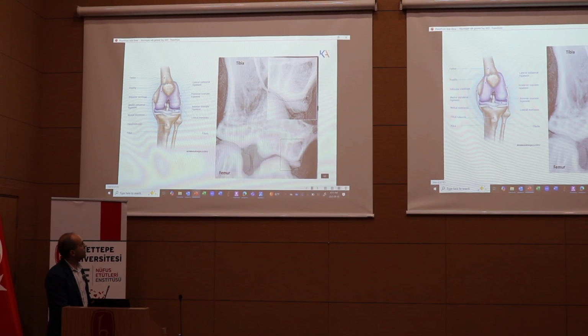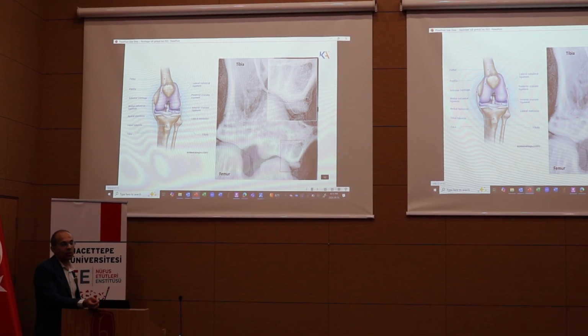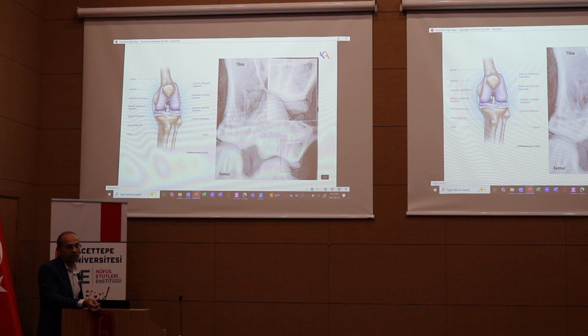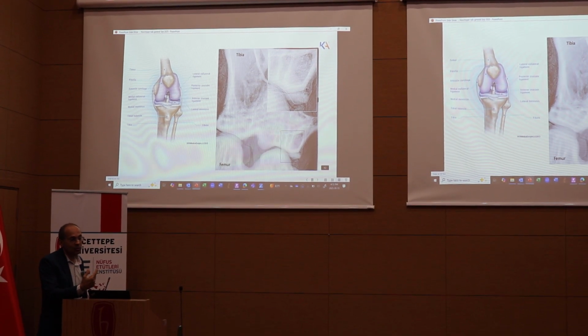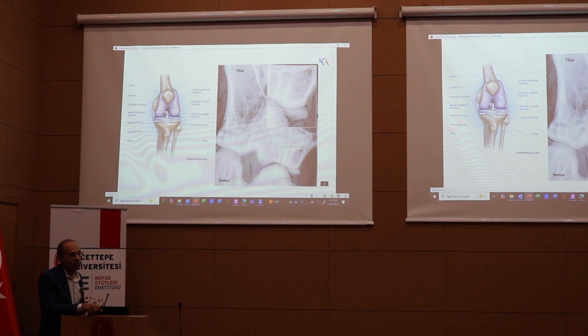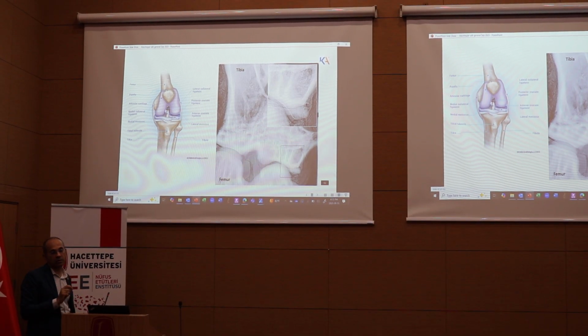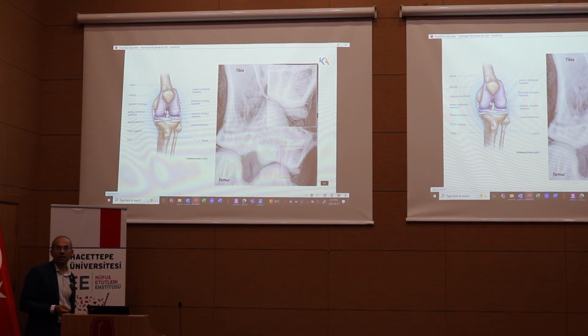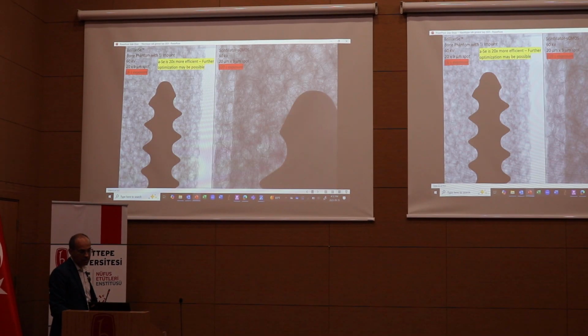What's unusual about this is you cannot see cartilage with an X-ray. Anybody will tell you if you want to see cartilage, you're going to need ultrasound. But this is 50 micron resolution, so an ultrasound will not work. So the only thing that can resolve this is an MRI, where you would run it for like an hour or two to resolve it down to 50 microns. We did this in a single exposure, like literally 200 milliseconds, right? So nice application, lot of potential here.